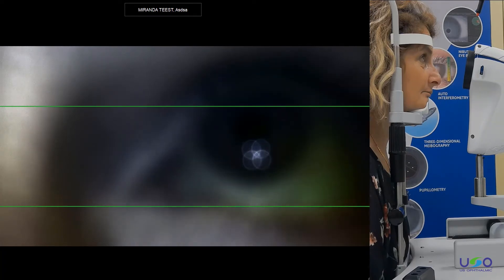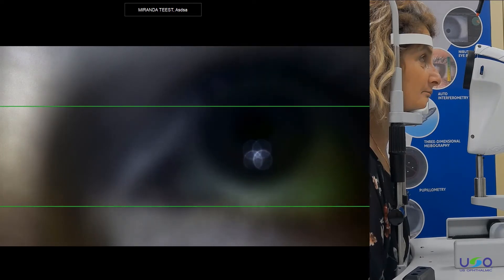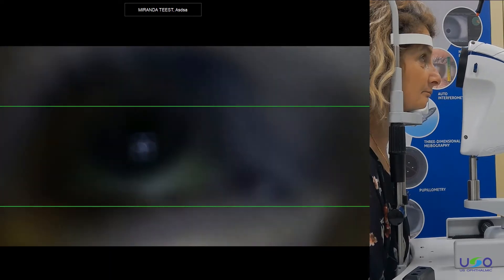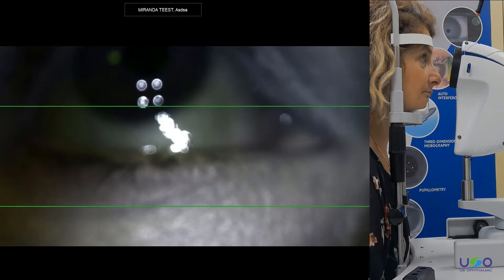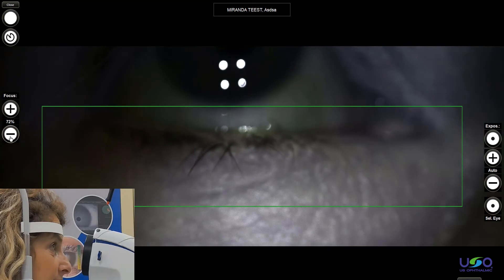In this way the lid becomes much more soft and tender and easier to be turned. I just clean my hands a bit. You can use your finger or you can use a cotton bud — it depends on what the doctor is more comfortable with. To be honest, I am much more comfortable with the finger. So again, we tilt the device a bit; don't push on the patient.